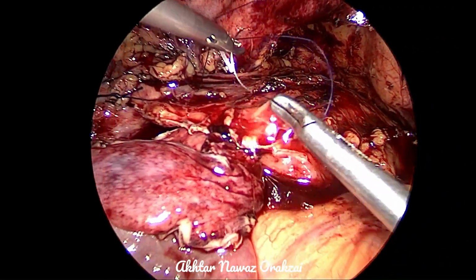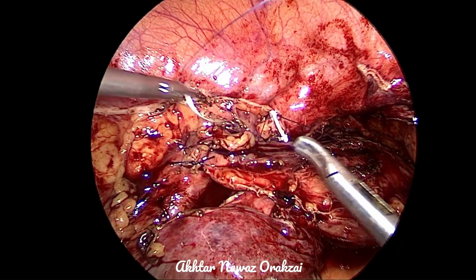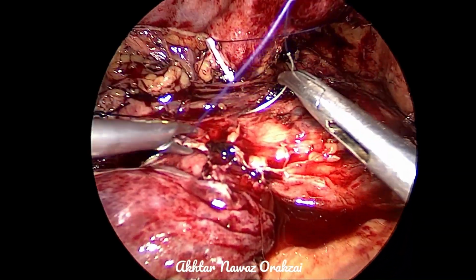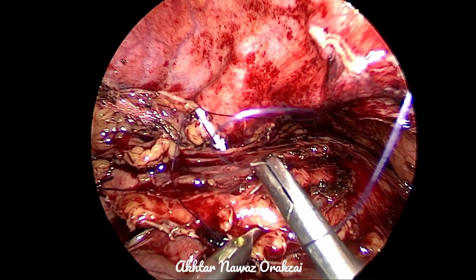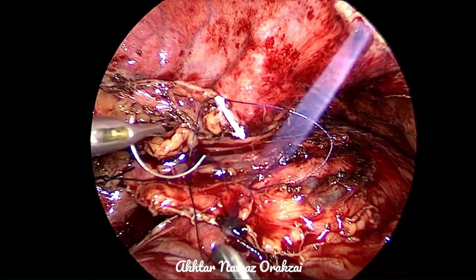And number 3, since the patient is here for obstruction and not a reflux, the main aim of this surgery is to remove the obstruction rather than to prevent reflux. However, we will consider a small submucosal tunnel if that can help.